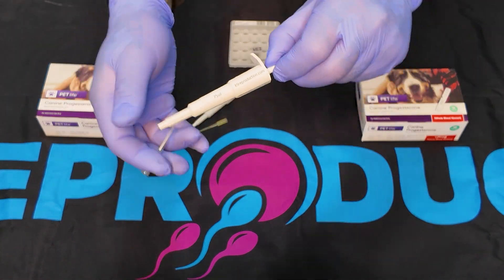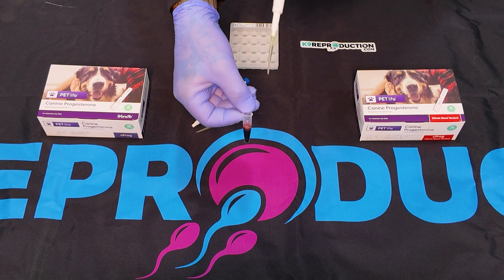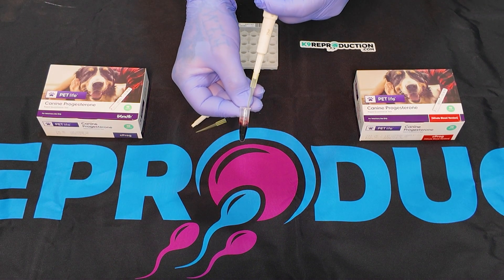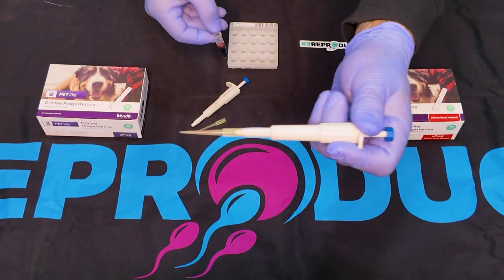For the Wanfo Serum Test, we'll be using a 75UL fixed pipette. Our Canine Reproduction Pipettes, available at CanineReproduction.com, are perfect for this task. Extract 75ULs of clear serum into the pipette tip.